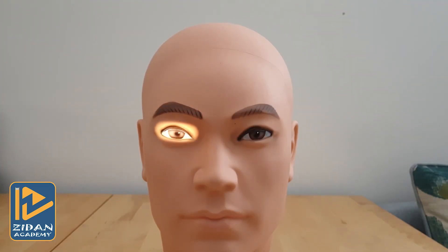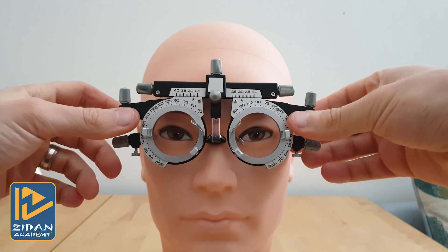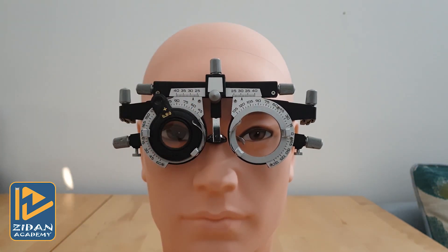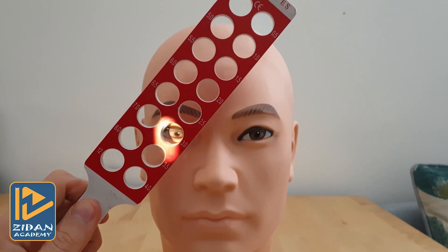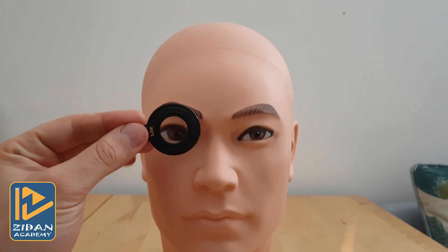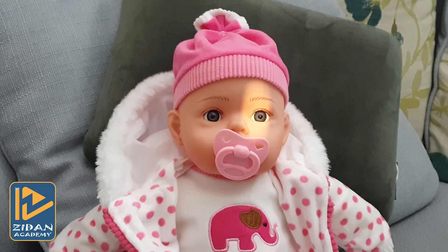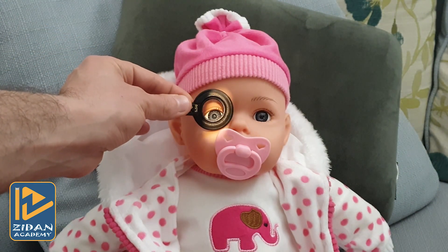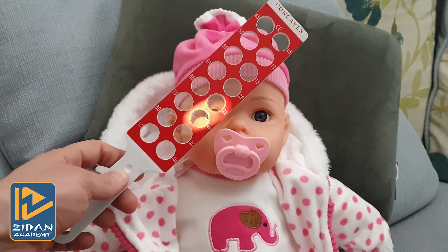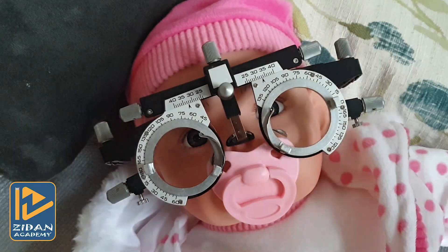If you are performing refraction on an adult, you can use either a foropter with lenses, a trial frame with trial lens set, a retinoscopy rack, or you can use loose lenses in front of the patient's eye. If you are doing retinoscopy for a child — especially infants — you may only be able to use loose lenses or a retinoscopy rack, as putting a trial frame in front of an infant's eye is not a good idea.